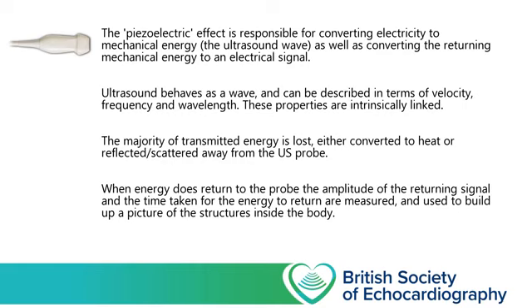The ultrasound beam that we pass into our patients behaves like a wave, and the key properties of that wave are its velocity, its frequency and its wavelength, and these properties are linked intrinsically. Most of the energy that we send into our patients is lost, it never comes back to our probe, with the vast majority being converted to heat. But when that energy does come back to our probe, we can measure how long it took to get back to us and how much of it returns, and use that to start building up a picture.